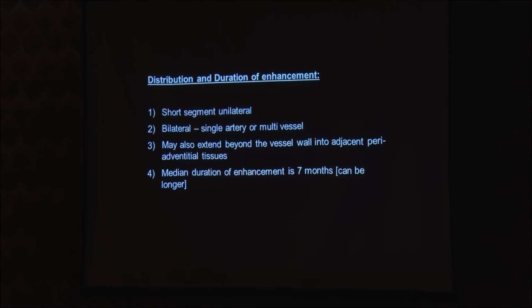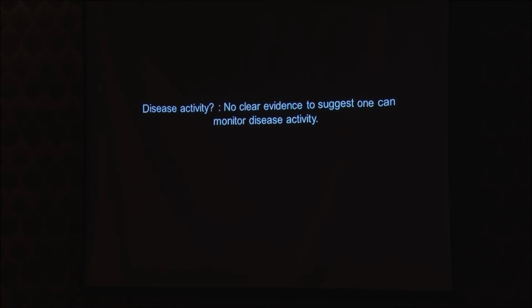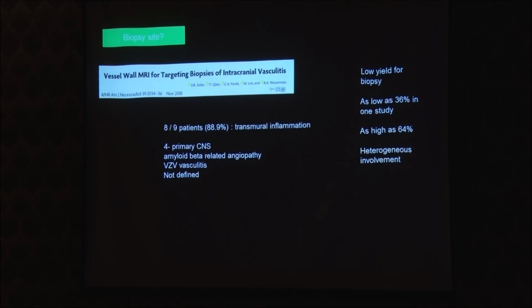And the enhancement lasts for a long period, 7 months, 9 months, 12 months. Even after treatment, it can persist. So that doesn't mean the disease is active. So are there any studies to say that we can actually monitor disease activity? There is paucity of studies right now.